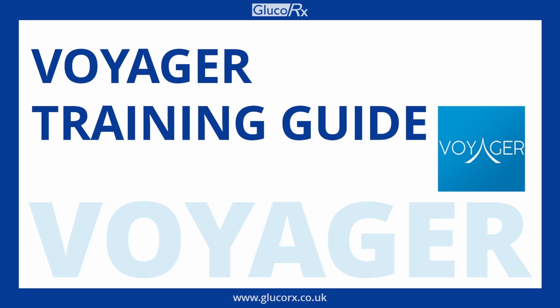Today we will be covering how to upload readings from your GlucoRx blood glucose meter to your computer.